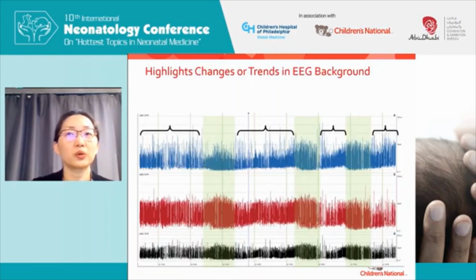And so if you were looking at several hours of recording on a newborn, you would very easily be able to see the change in trends as the baby went through alertness, awake, and quiet sleep, just by getting an aerial view. And again, being able to step away and see that EEG tracing over hours rather than milliseconds and seconds.